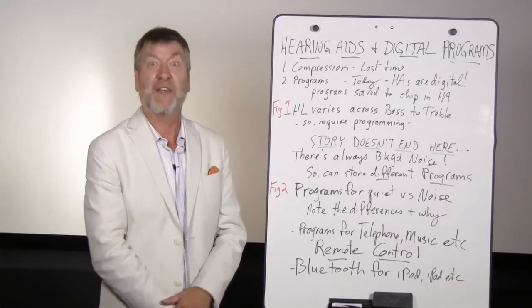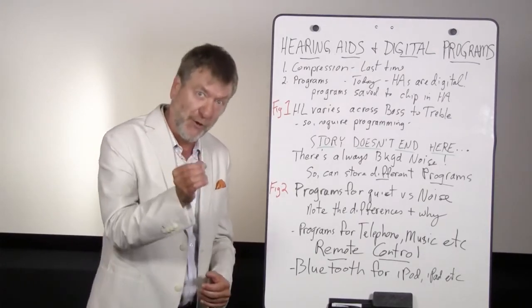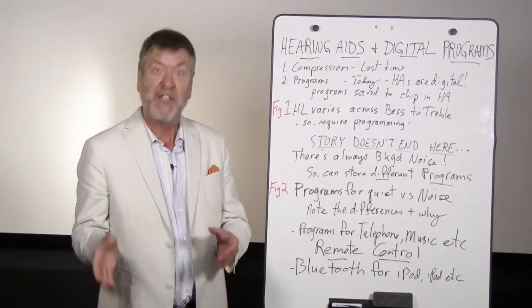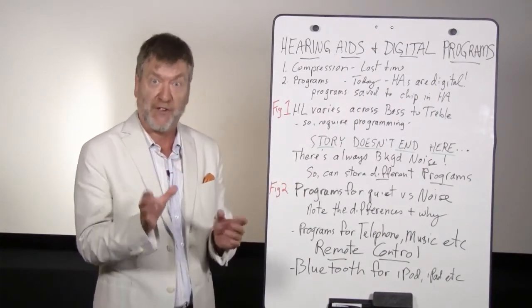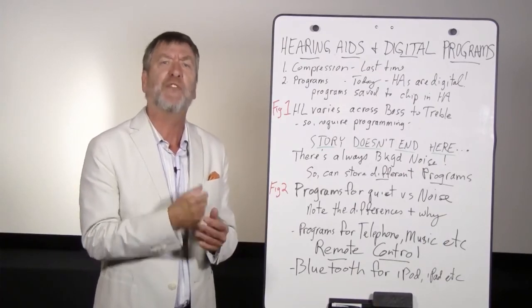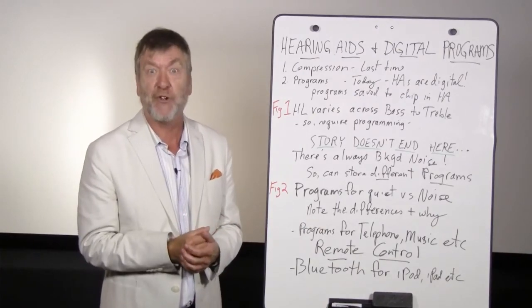There's even more to the story. We'll talk about that in the next segment dealing with directional microphones and digital noise reduction. So now we've covered compression in hearing aids, and we've covered programming in hearing aids and stored programs in hearing aids for different listening environments. Next time we'll talk about the unique requirements for listening to speech and noise. Directional mics, digital noise reduction.